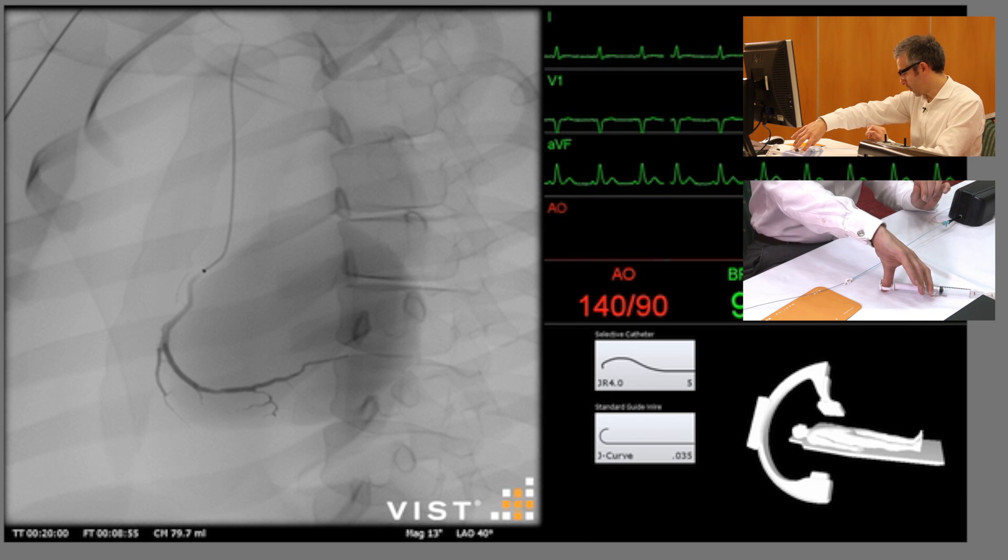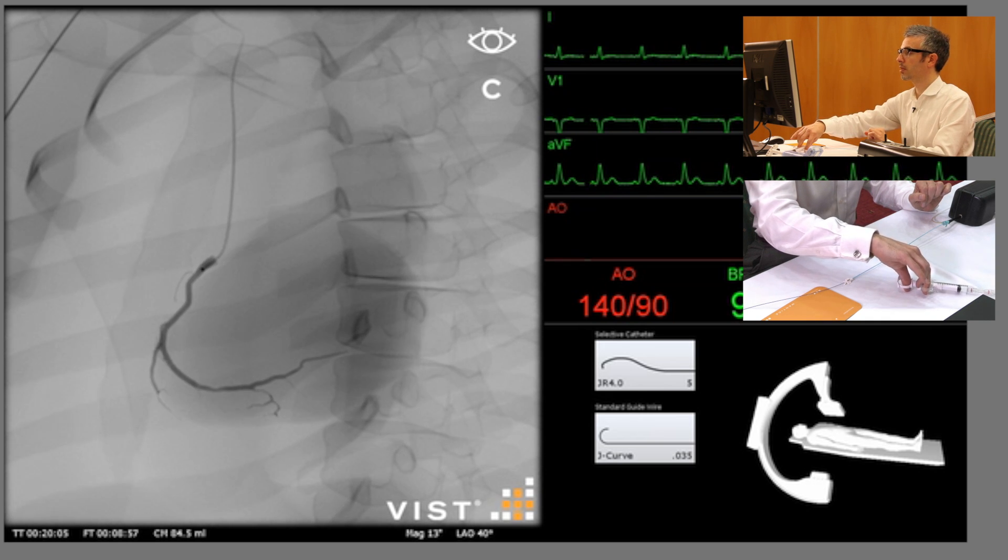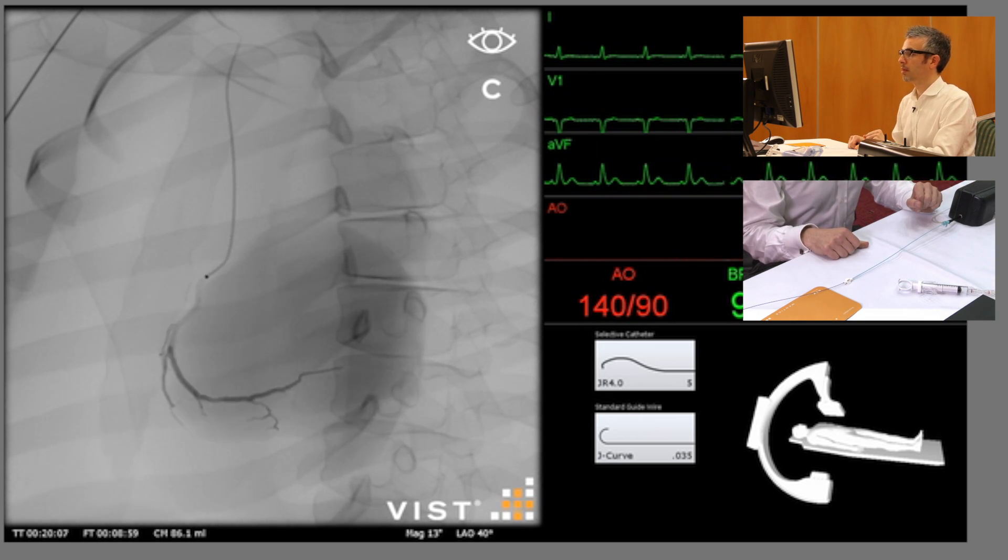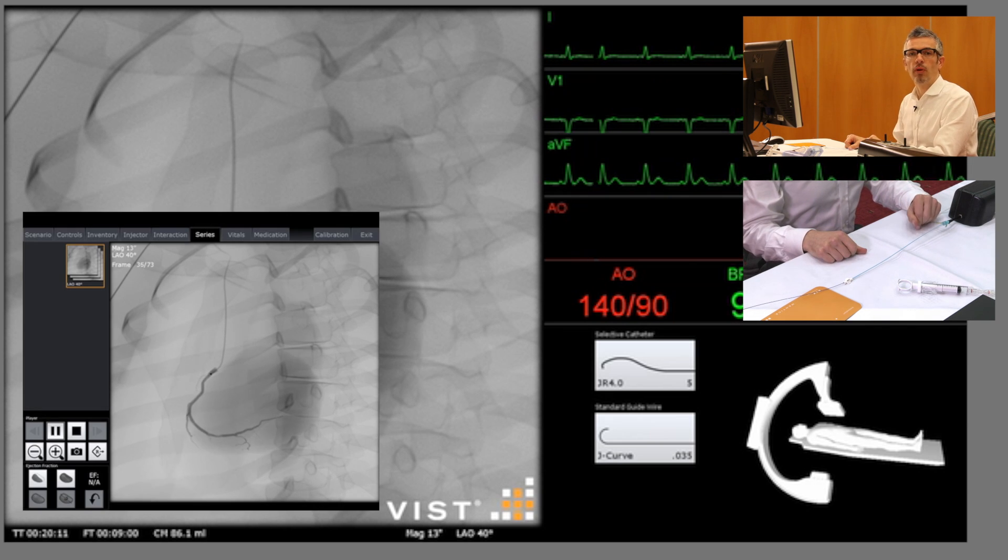Now we can take our angiogram, come onto the cine pedal, re-inject. And that's a coronary angiogram of the right coronary artery.